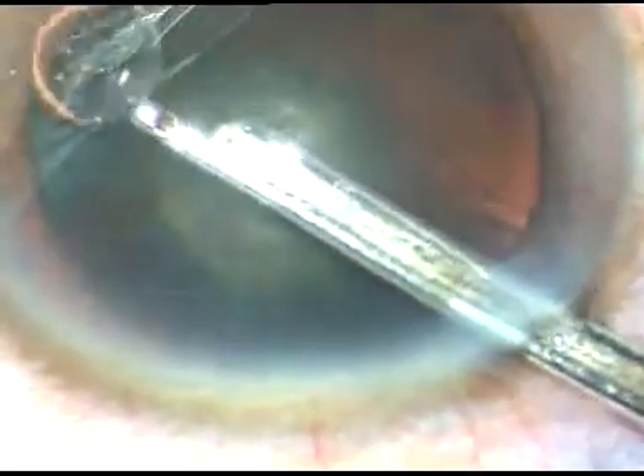Now, in this case, I am going to do an adequately sized capsulorhexis. The rhexis size I aim for is 5 mm, or between 5 and 5.5 mm.